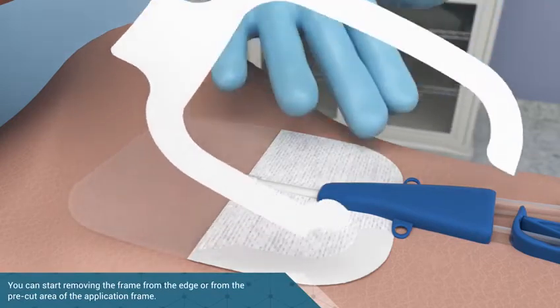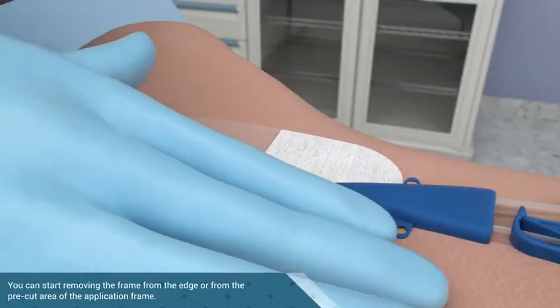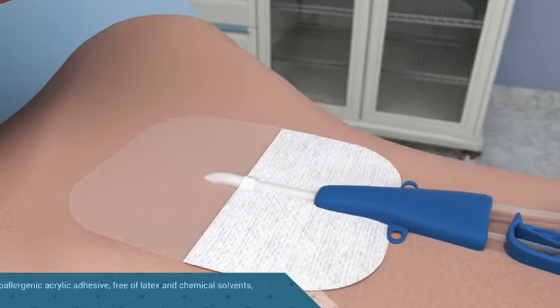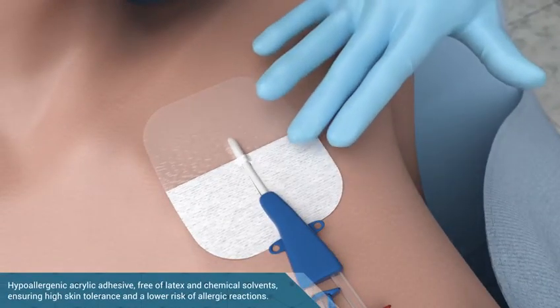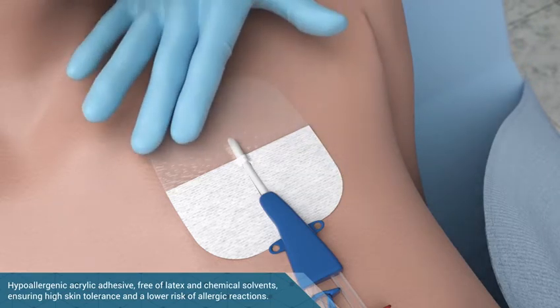Slowly remove the frame and press along the edge of the dressing as it peels off. Lightly press on the film to help the dressing adhere to the skin and the catheter connector.